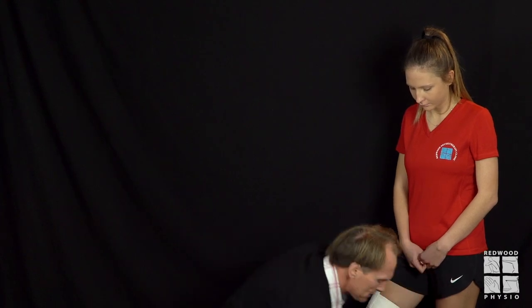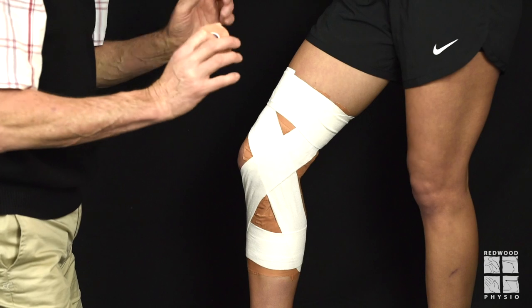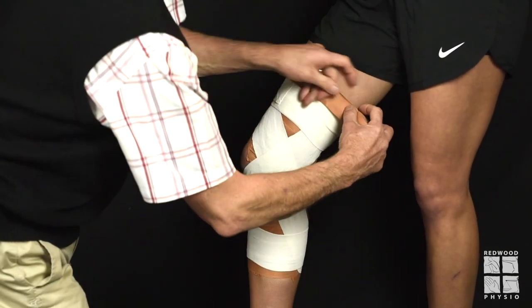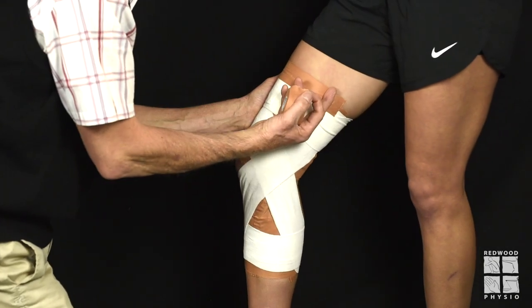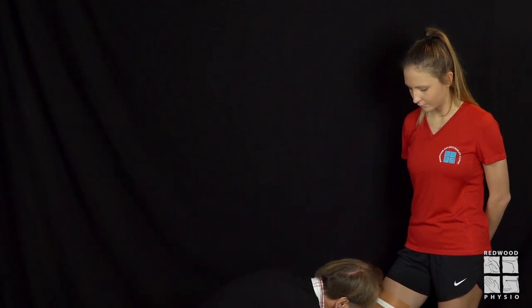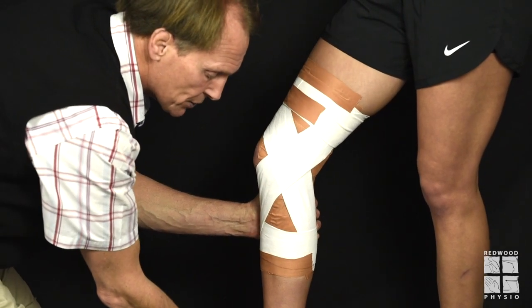You have to anchor that EAB in place — this is very important because otherwise the tape would completely fall off. So very simply, 38mm half EAB, half skin. We've got a bit of an edge here; if you're actually playing sport that's going to flick up, so we want to strap that down. Top and bottom.